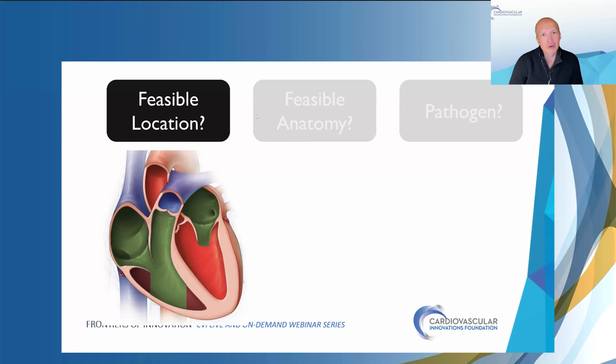But from an IJ approach, it's pretty easy to reach because first of all, you have a shorter distance with the catheter, so you have a little bit more catheter length, and the orientation towards the valve is a little bit more favorable. And you can even go up and grab stuff in the pulmonary artery too, if you wanted to. Abdallah, do you agree with that?